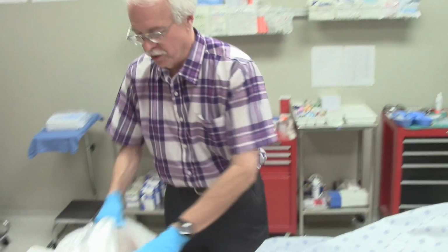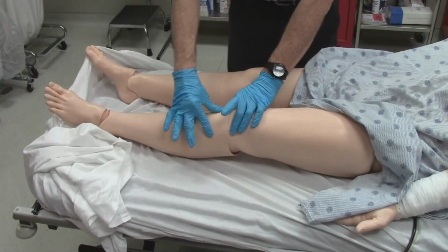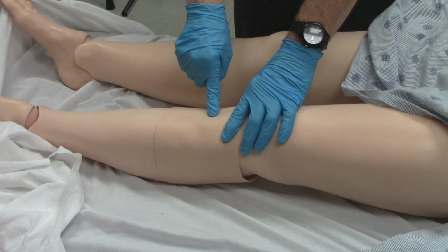It is possible to place a Foley catheter into the patient, and if the instructor wants to, we can set the mannequins up so they will return urine through the Foley catheter. You'll need to talk with your instructor about whether or not the mannequin is going to be returning urine during your simulation, or whether that's something that you'll just be told. You'll notice that on the patient's left leg, we have another site where an intraosseous line can be placed.